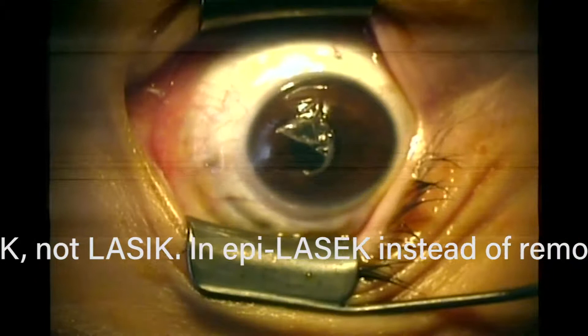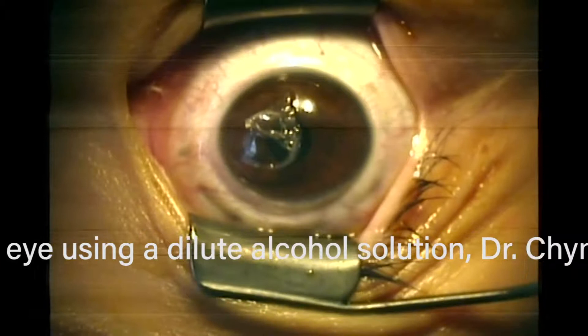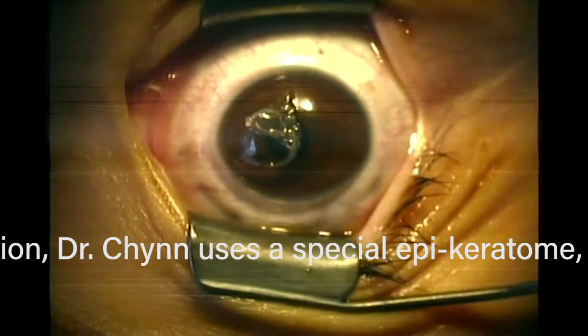Because it's plastic and blunt, it's not actually sharp enough to go into the cornea, so it's safer than LASIK. With LASIK, sometimes you get a bad flap. If you get a bad flap, it's a problem for the surgeon and the patient too, because we don't have synthetic cornea — we would just be stuck with a cornea that's abnormal because of a bad cut.